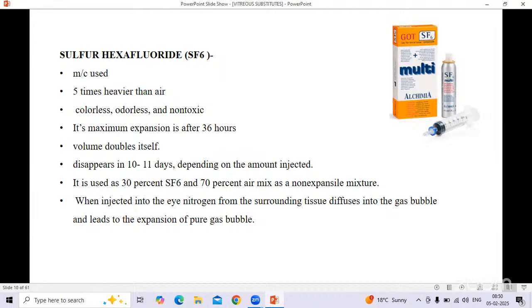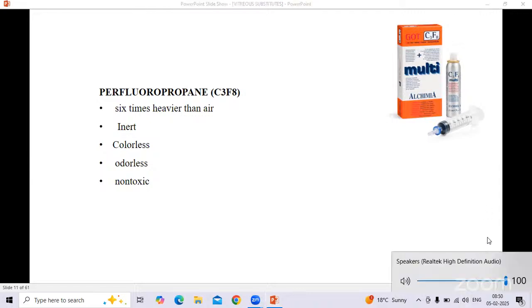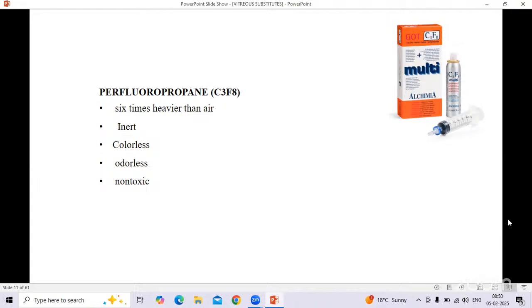In that book, they have a table of non-expansile concentrations and everything, days, and time to get double the gas, and how long it lasts. Okay. 18 to 20%. Can I go further?